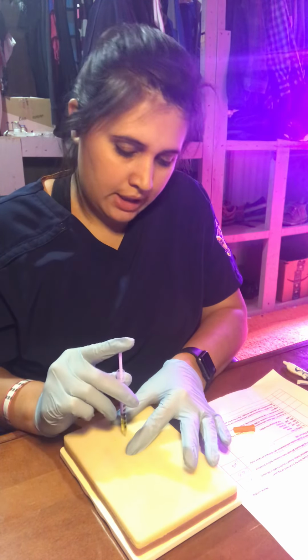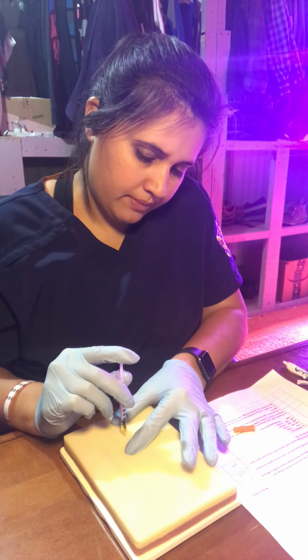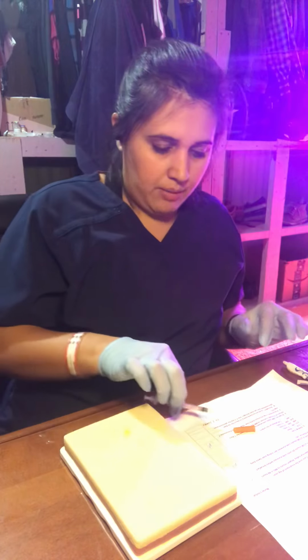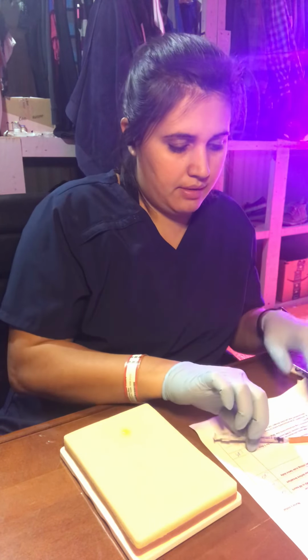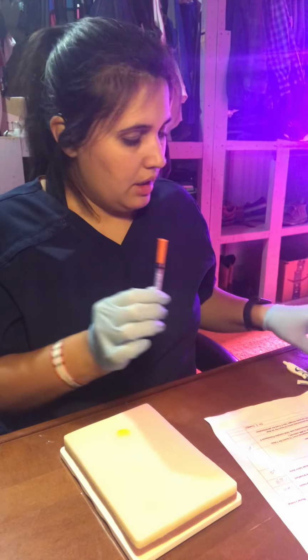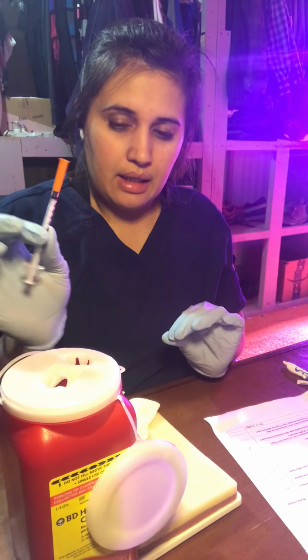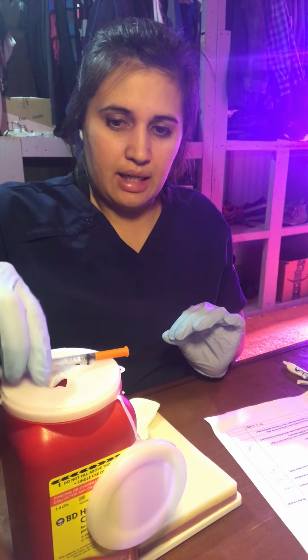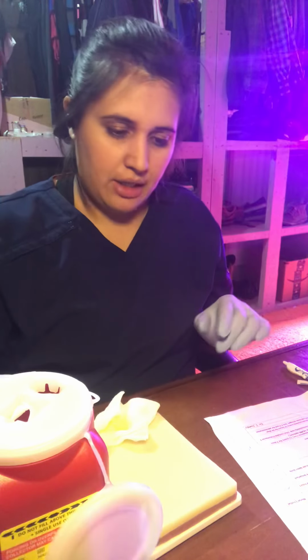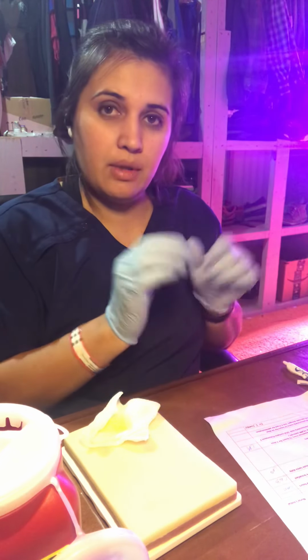Holding it secure, I'm going to press the medication in slowly. And then I'm going to pull straight out. I am going to recap, use the gauze for any blood, and dispose of it in the sharps container. Then I will document in the MAR that insulin was given, at what time, and how much.